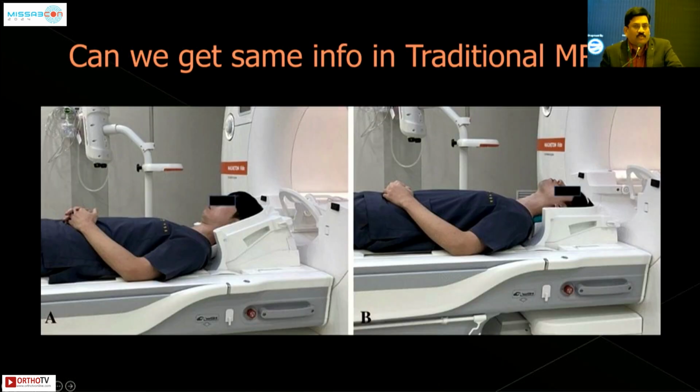So how can you approach this information? How can you put it into regular practice? Because access to this kind of MRI may not be available everywhere. So there were attempts initially to get flexion-extension MRIs in the supine position. But we also compared these values between supine versus loading in sitting. So we could see a significant difference by just sitting with the head load on, without any neck movements.